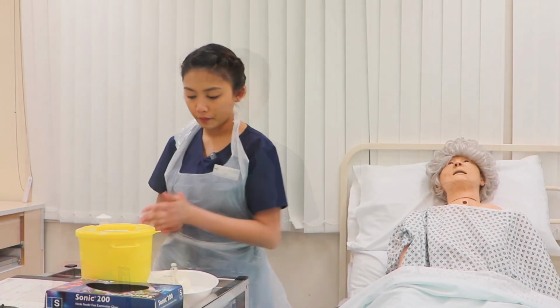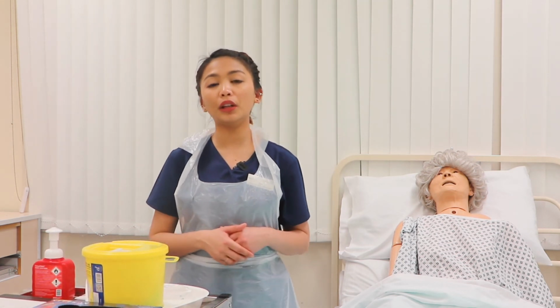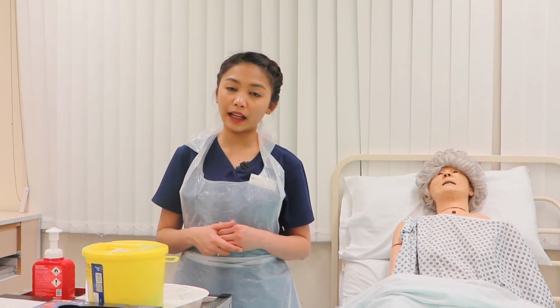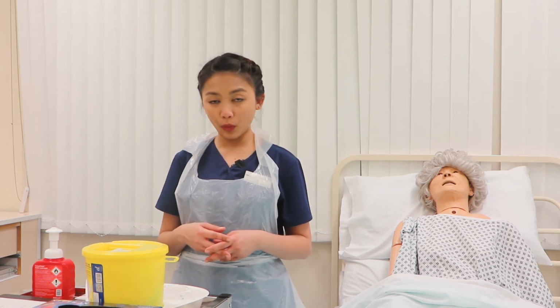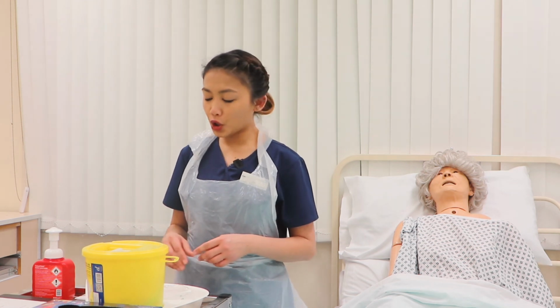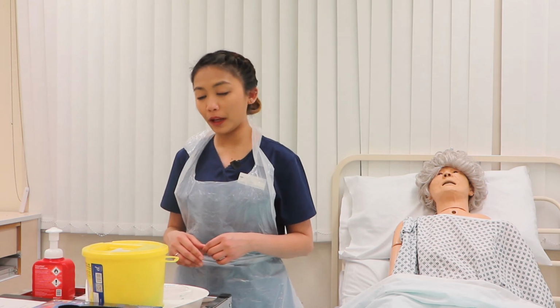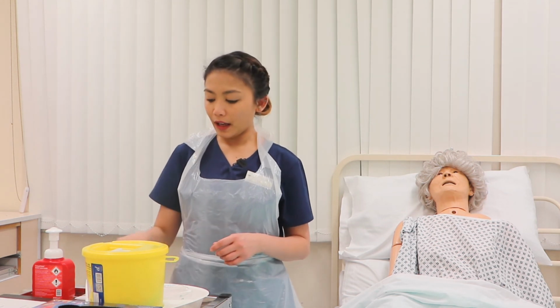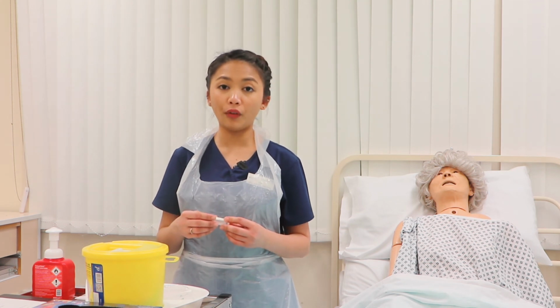Unwrap. For my aftercare, everything that touches the patient, including my gloves and apron, will go to the clinical waste bin. And other wrappers and rubbish will go to the domestic waste bin. And the sharps will go to the sharps bin. And the tray and other materials will be cleaned and disinfected for the next use and be placed back in the right places. And I will make sure that the storage of the medication will be according to the manufacturer's policy.